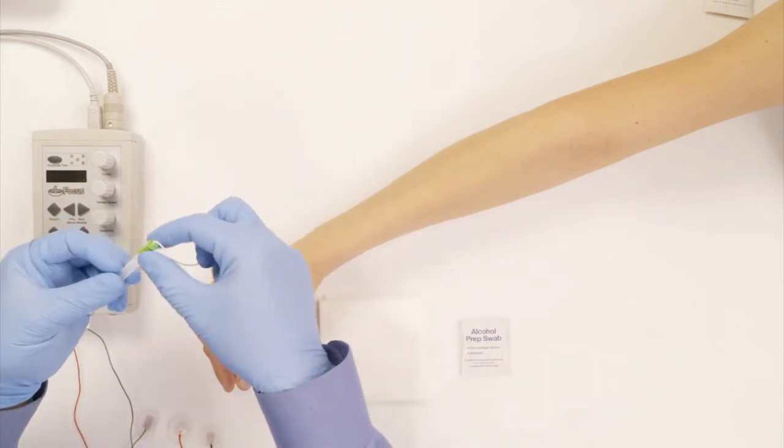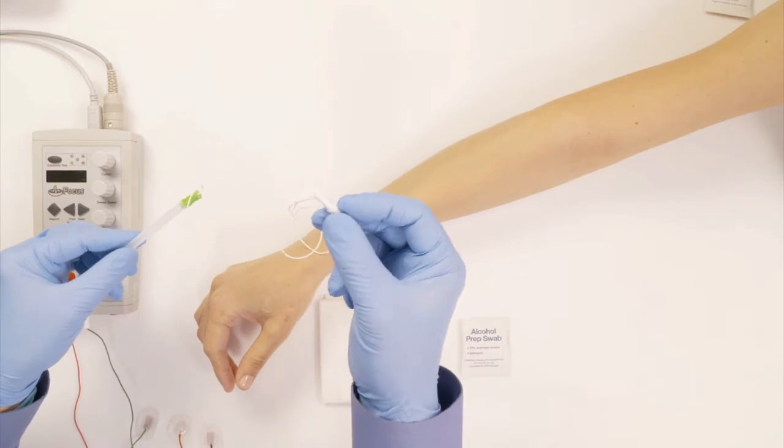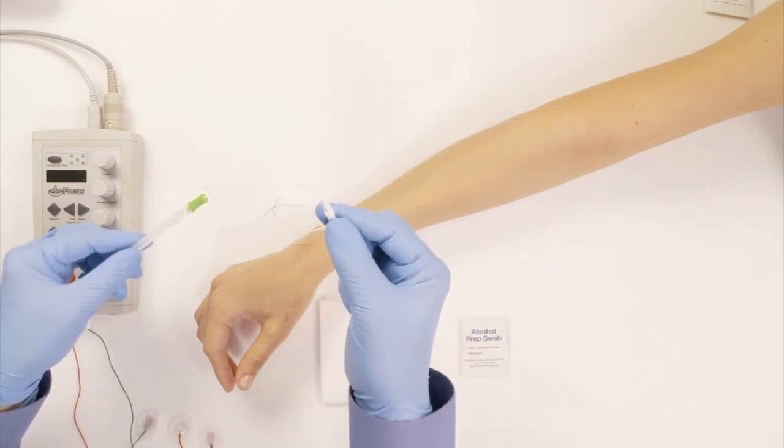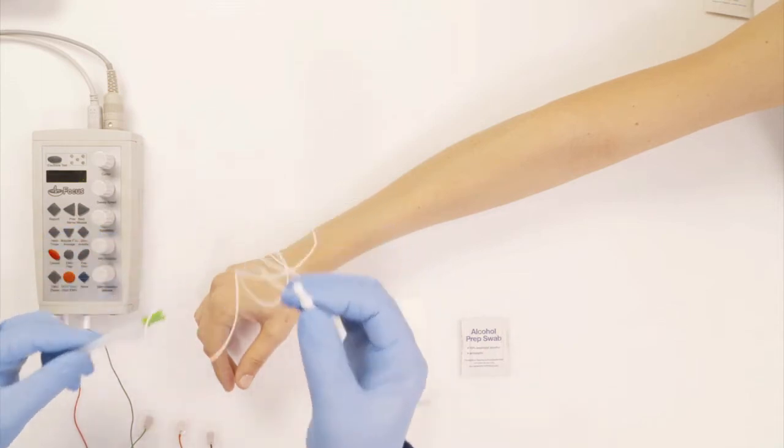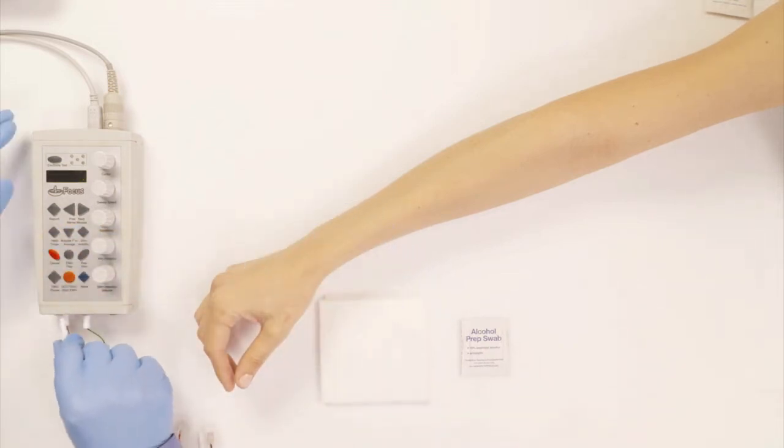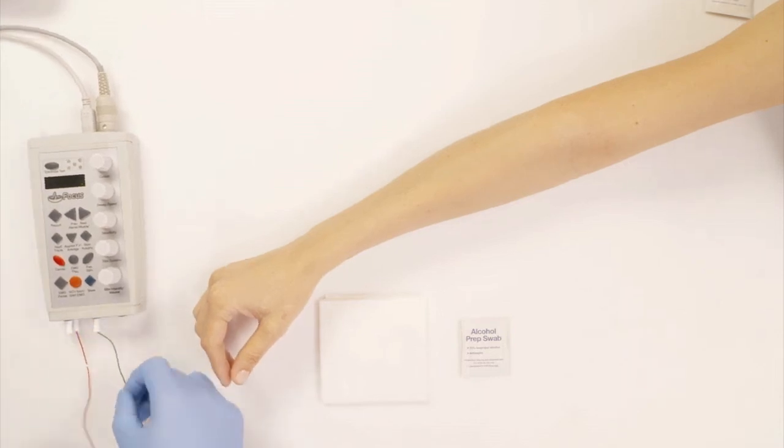It's one use only, and it's delivered sterile, obviously. And this is the wire that comes out of the needle. Imagine as though it's black because that's going to be the active electrode. So I'm going to plug this into the black part of the electrodes. Here we go. And now I have it this way.